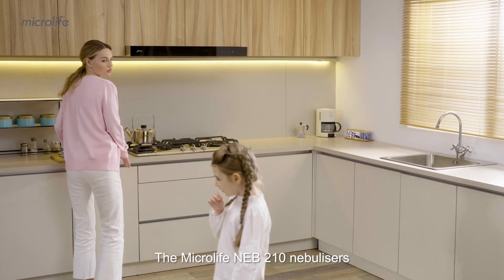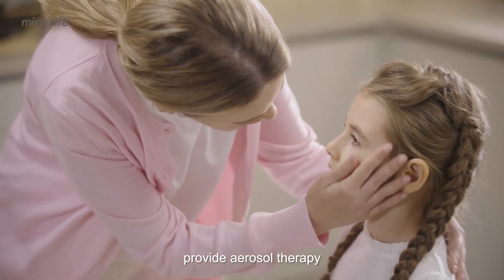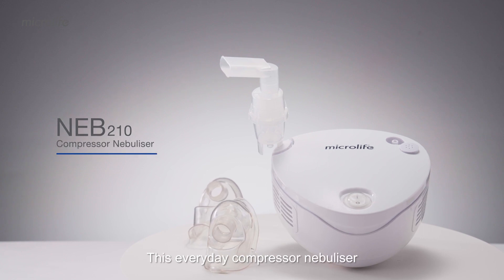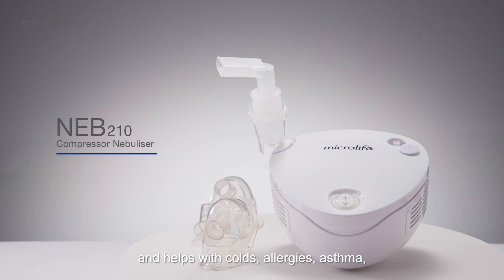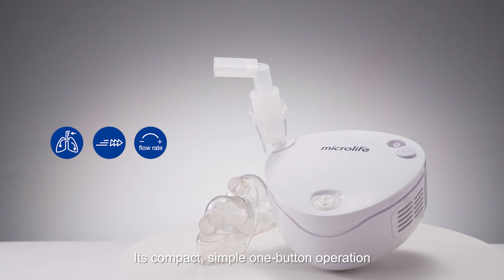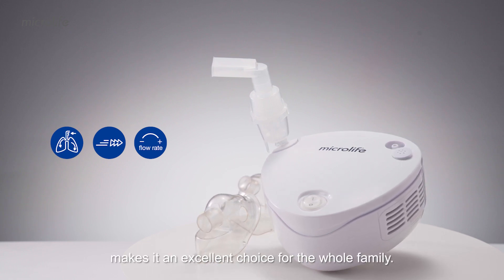The Microlife NEB 210 nebulizer provides aerosol therapy that can alleviate upper and lower respiratory conditions. This everyday compressor nebulizer is suitable for the whole family and helps with colds, allergies, asthma, and other breathing problems. Its compact, simple one-button operation plus efficient treatment makes it an excellent choice for the whole family.